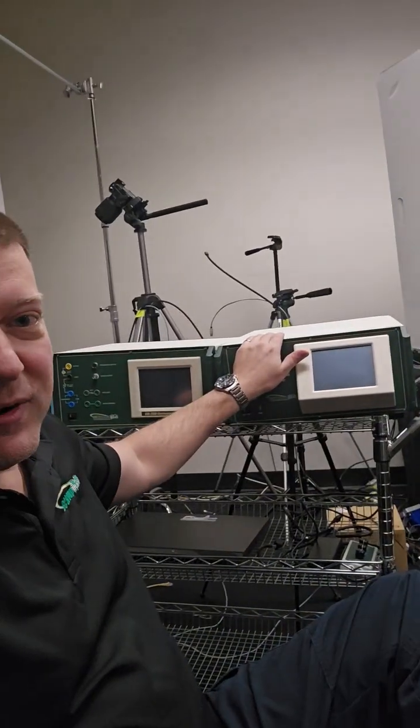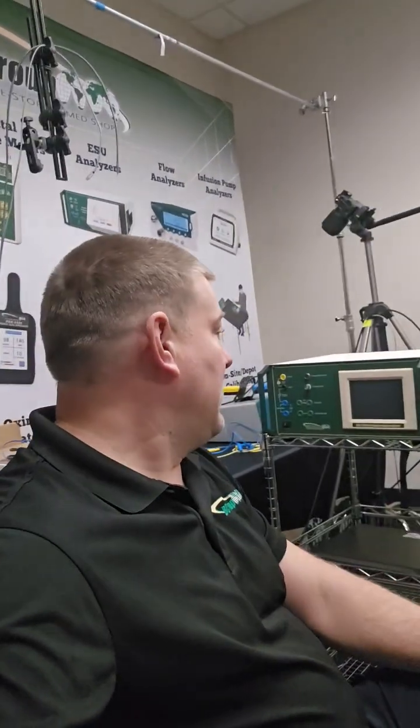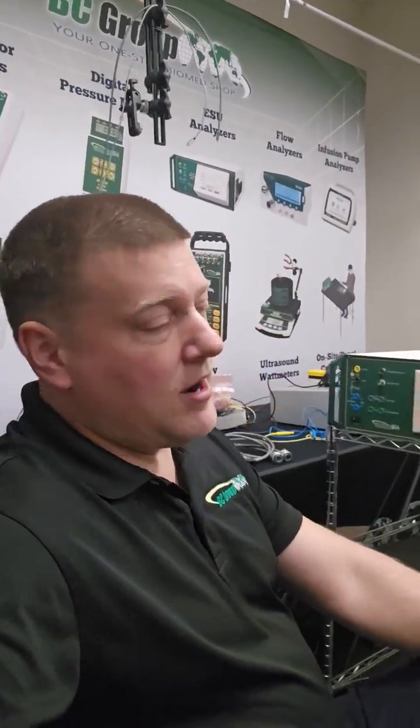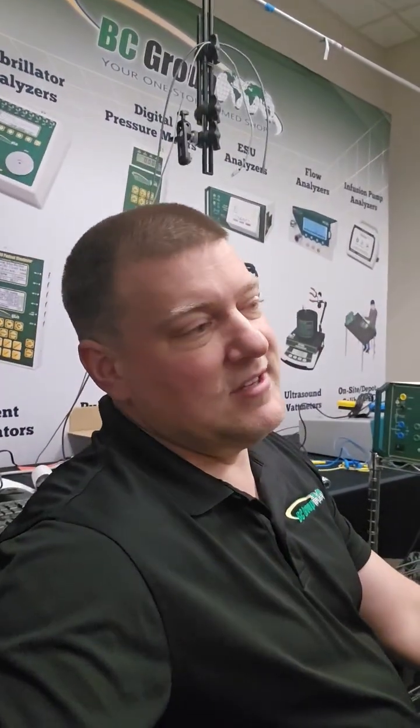We have the 2400H — that's the high frequency model — and I've got the 2350 right here. Both of them are absolute powerhouses for ESU testing, and I've got all the cables here too. We're going to cover a little bit of the theory, some of the menus, and show you some new features using software for testing these units.